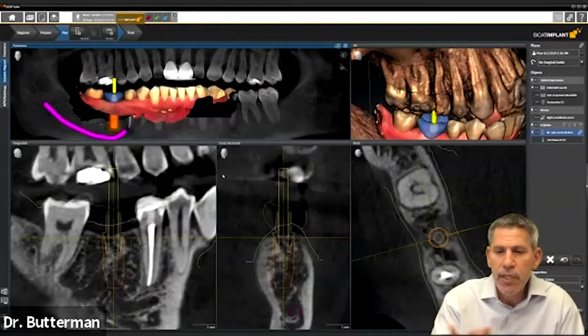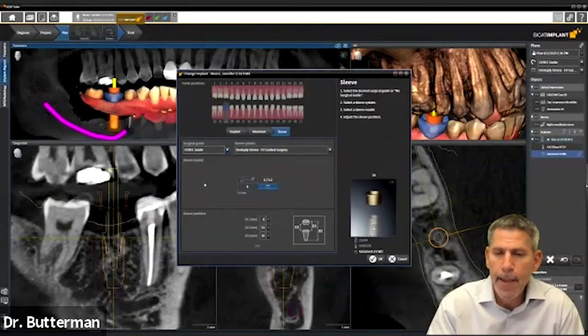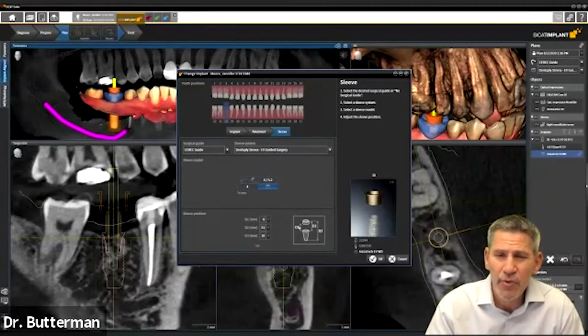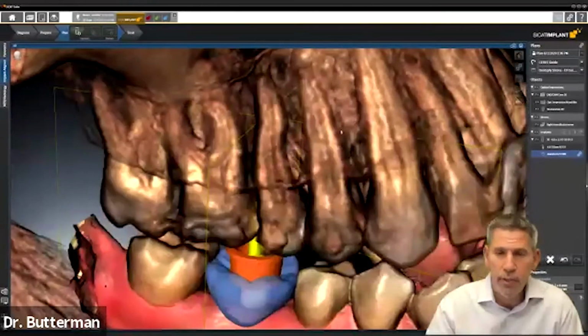Again, everything that you're seeing now, I do this live in front of the patient, and we're planning this together so that we understand, is this surgery that can be done? And then also the patient, they've never seen anything like this level of treatment. They've never seen this level of diagnosis, and they're just blown away by it. Acceptance is not automatic, but it's getting close.